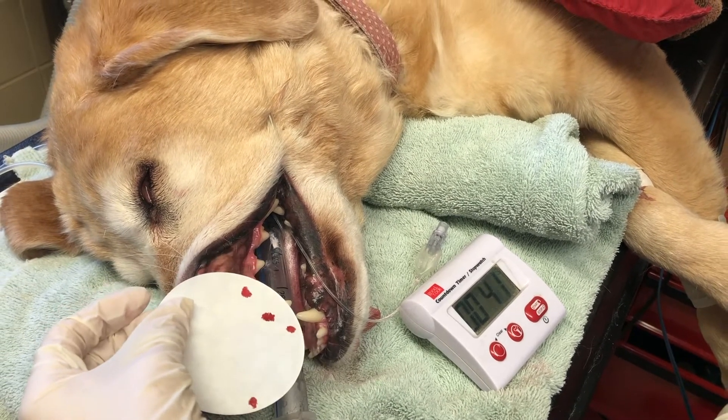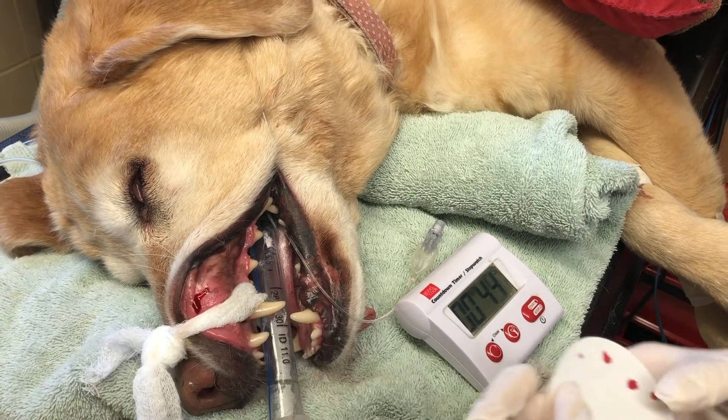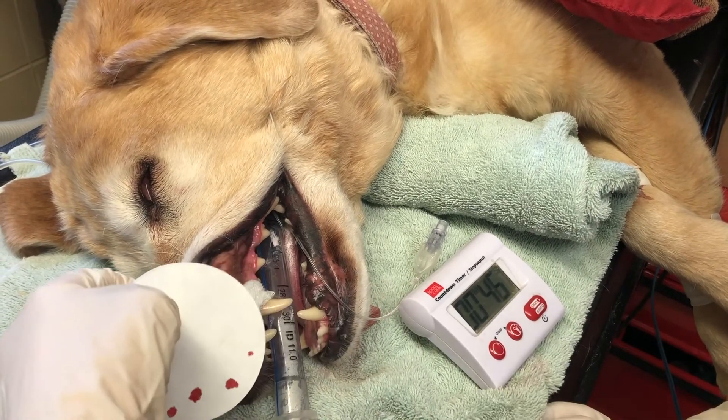So we're just going to keep doing this until our bleeding has stopped.